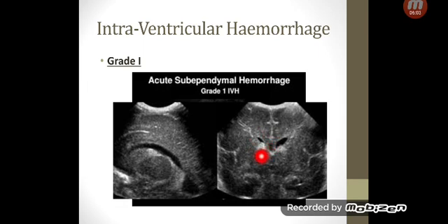You can sometimes be not that sure about this being a hemorrhage, right? Because what if it's a choroid plexus? Because you can find something here as well, so that can be choroid plexus, and your angle might be not brilliant, like your probe might be a bit tilted. But then you go for the sagittal view to confirm your concerns, and it's there.